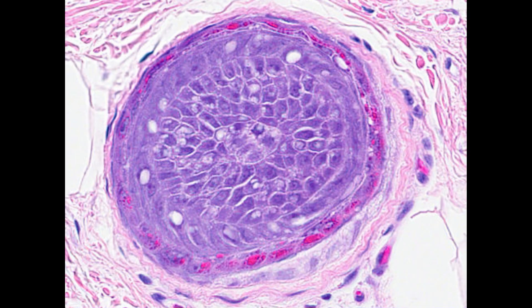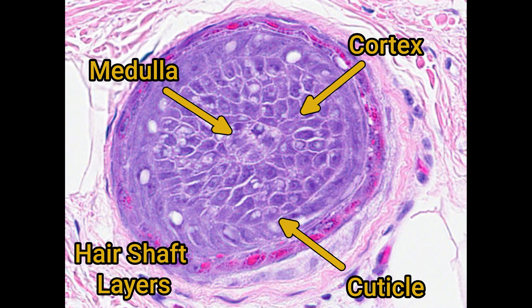Moving up the hair follicle, the dermal papilla disappears and the matrix cells begin to differentiate into cell lines that will form the hair shaft and those that will form the follicular epidermis. You can start to see differentiated cells forming discrete layers. The hair shaft is formed of three layers: the medulla in the centre, the cortex in the middle, and the cuticle around the outside. The next two layers form the follicular epidermis.